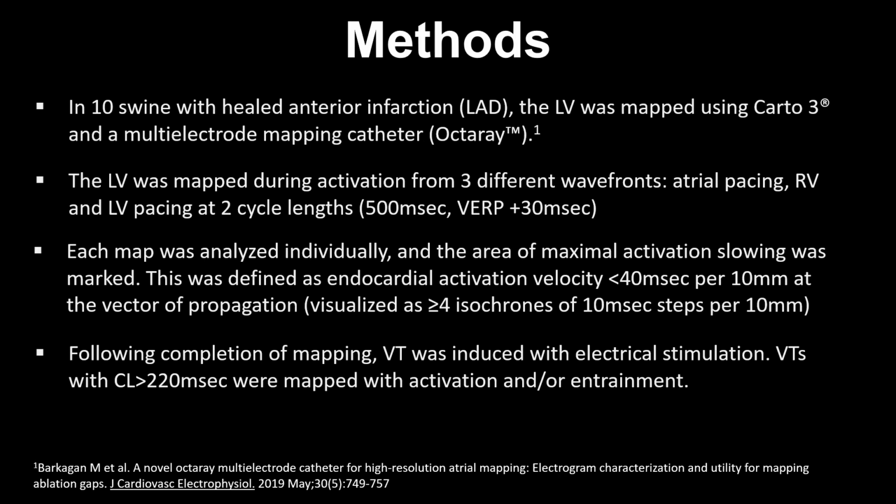Activation slowing was defined as conduction of less than 40 milliseconds per 1 cm distance in the vector of propagation. For each map, the area of maximal activation slowing was marked individually. Following completion of mapping, VT was induced with electrical stimulation and mapped with activation or entrainment.